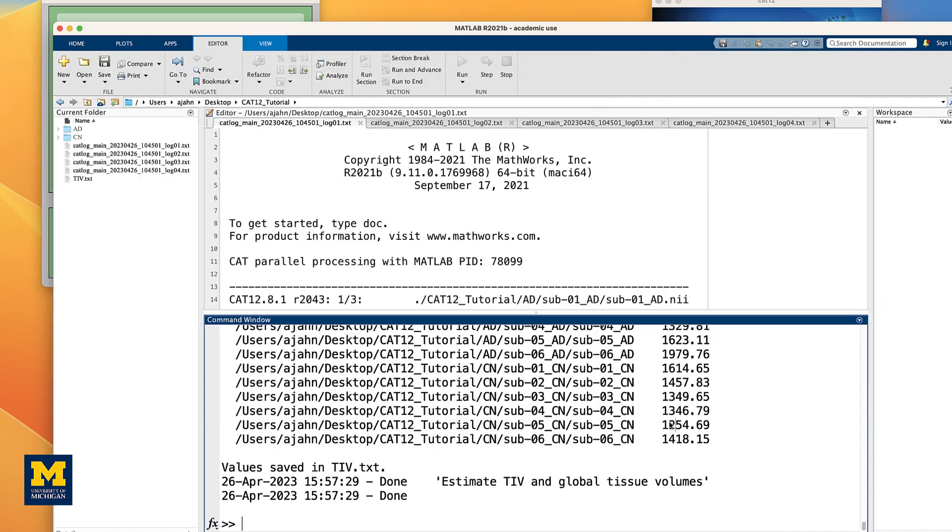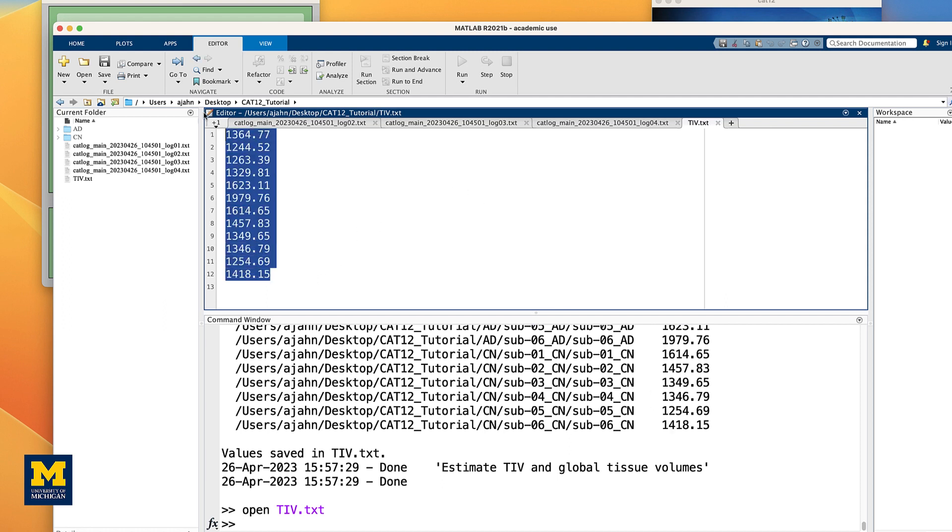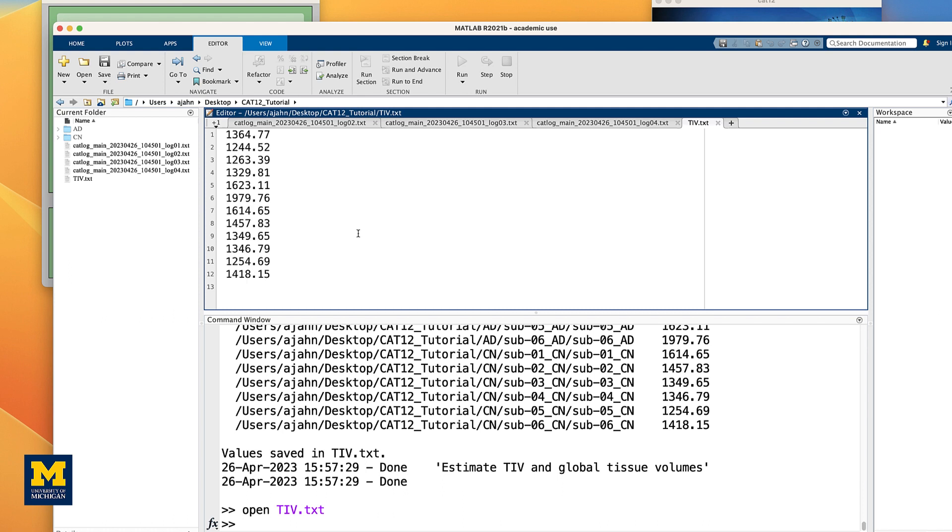This only takes a second, and you can see whether it finished by going to the MATLAB terminal. You should see a new file called TIV.txt. For example, open it with the command open TIV.txt, and look at the values. These will be in the same order as the XML files were loaded, which if all the other steps have used the filter field and recursive command when selecting files, should be the same as when we load them during group-level analysis.